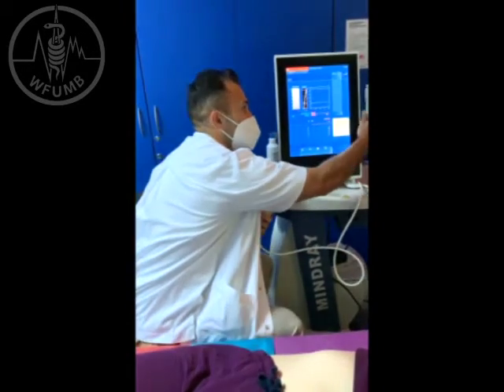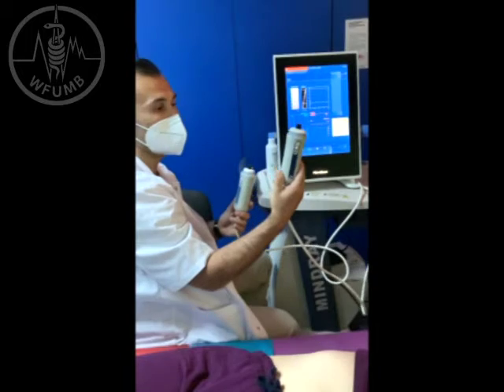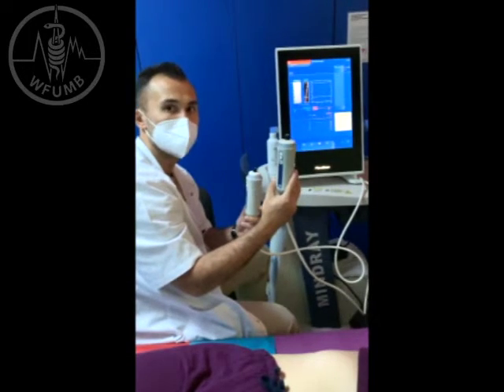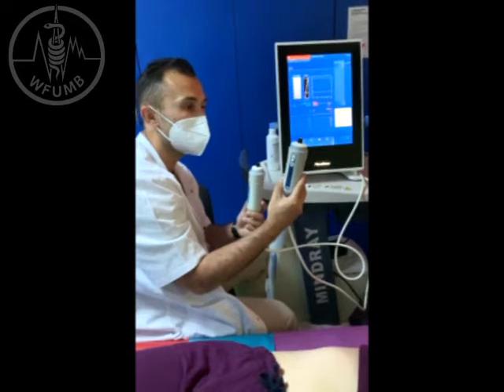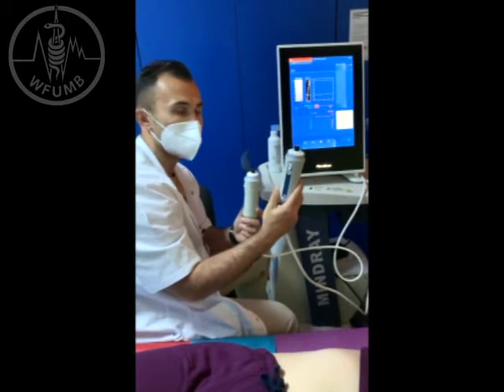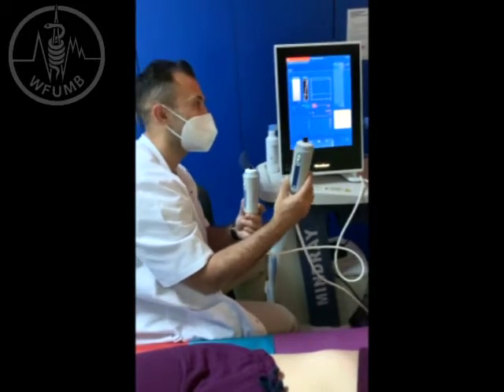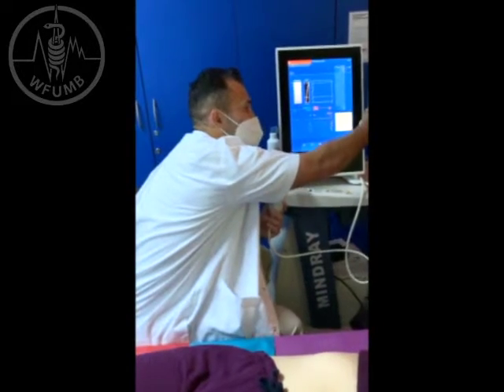Afterwards, the XL probe was released to overcome these limitations of the M probe, which led to an increase in the technical success rate above 90%.